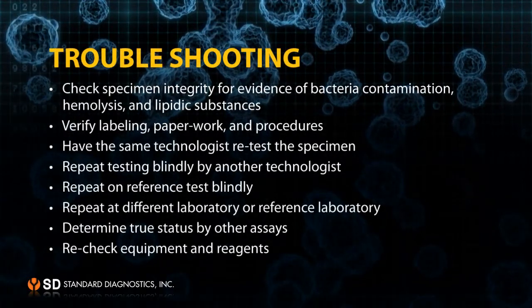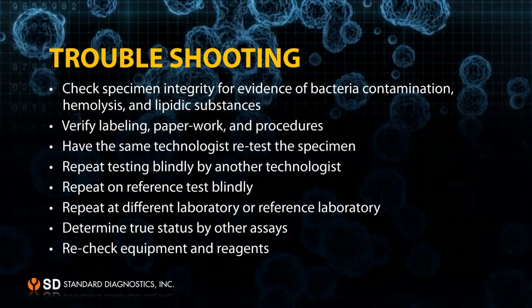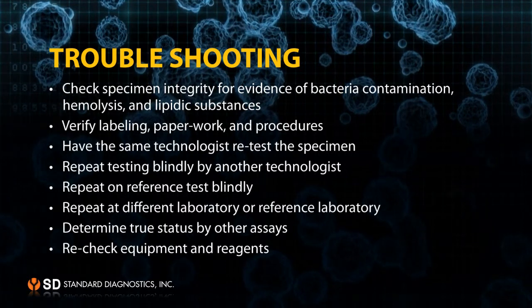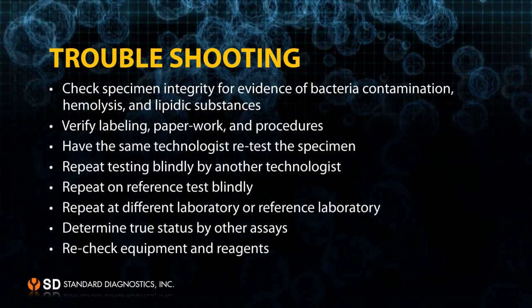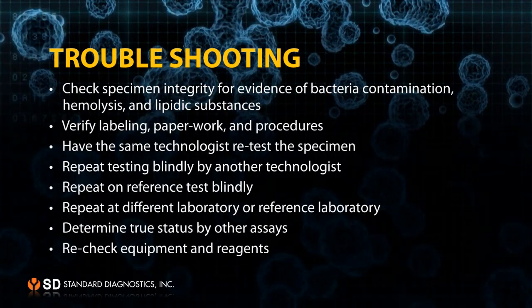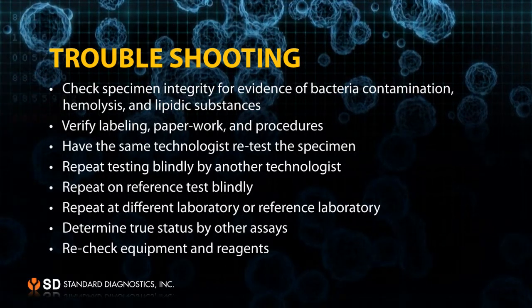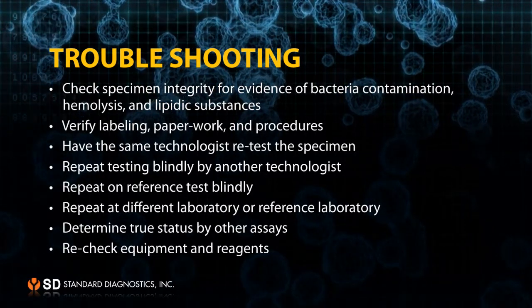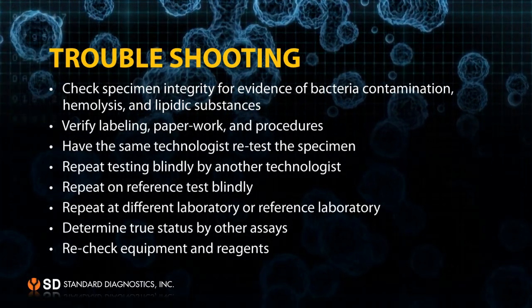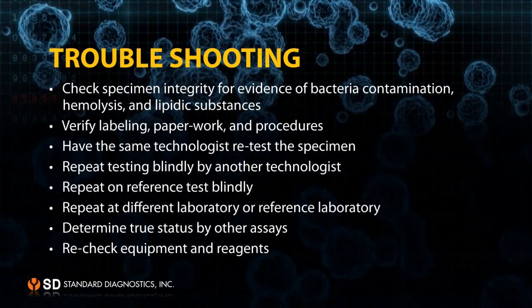When you have a problem with your test, it could be solved by the following steps: check specimen integrity for evidence of bacterial contamination, hemolysis, and lipidic substances; verify labelling, paperwork, and procedures; have the same technologist re-test the specimen; repeat testing blindly by another technologist; repeat on a reference test blindly; repeat at a different or reference laboratory; determine true status by other assays; and re-check equipment and reagents.